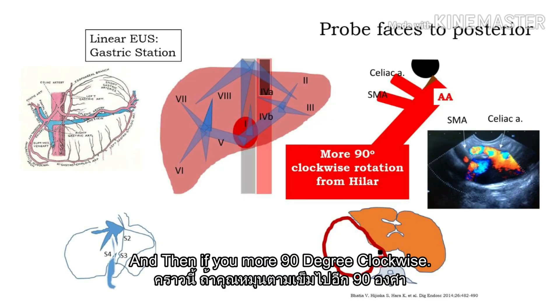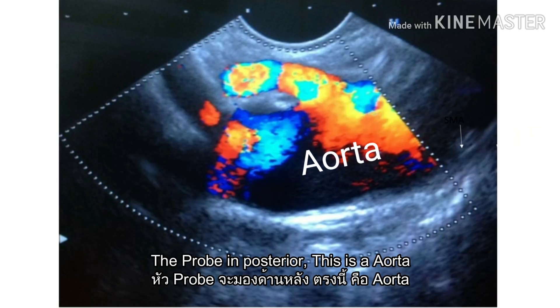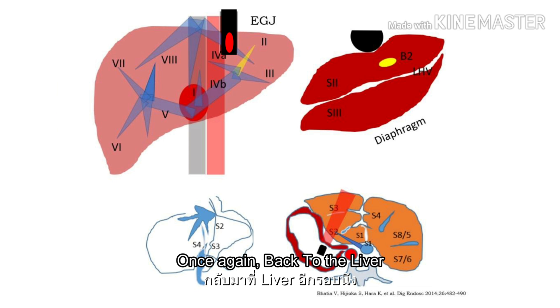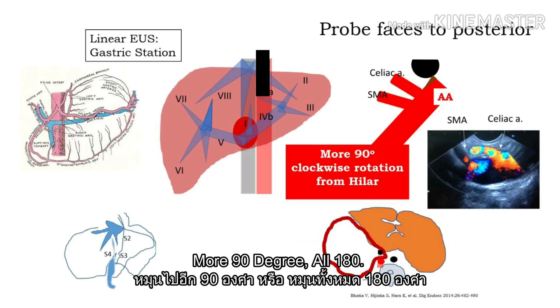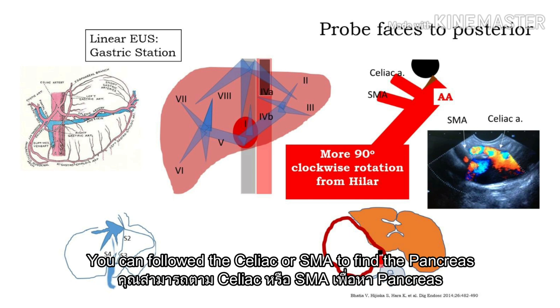And then if you move 90 degrees clockwise, the probe is in the posterior position. This is the aorta, and the first takeoff — the celiac. The second one is the SMA. One scan to the liver: 90 degrees — hepatic hilum. More 90 degrees, or 180 — the probe is posterior here. You can see the aorta, celiac, and SMA. You can follow the celiac or SMA to find the pancreas.